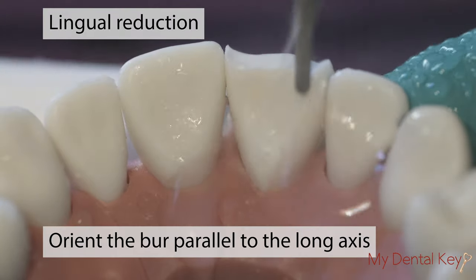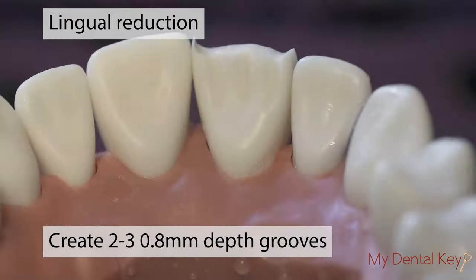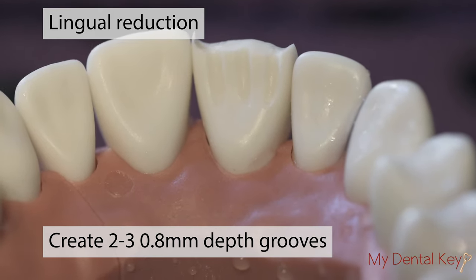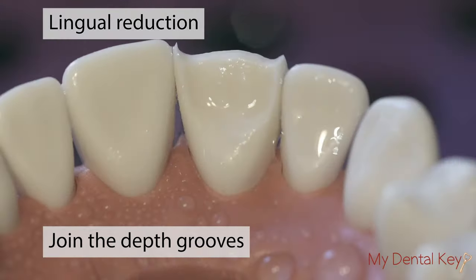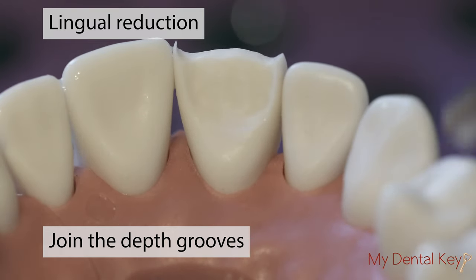Now, for the incisolingual reduction, again, create 0.8 millimeter depth grooves on the incisal third of the lingual surface. Join the depth grooves together, such that the final lingual reduction is 1 millimeter. Compare your reduction against the facial lingual reduction guide and use your probe to measure.